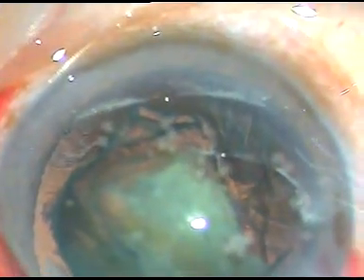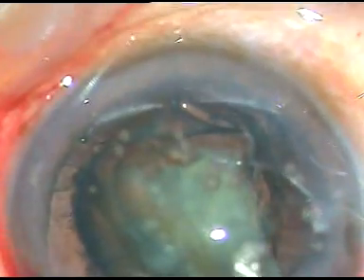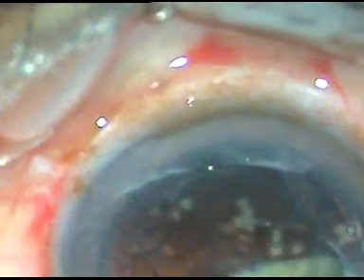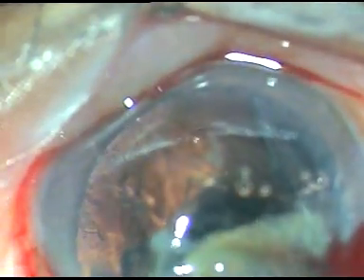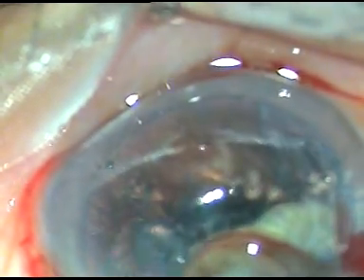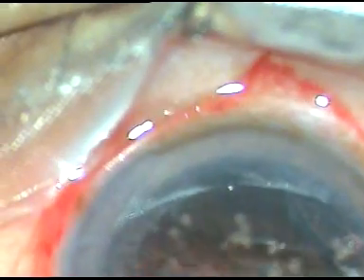Anyway, another mistake I made is that I came out. I should have injected viscoelastic substance and then come out, but I came out. I didn't inject viscoelastic substance. Now this should not be done. We should inject viscoelastic substance and then come out.